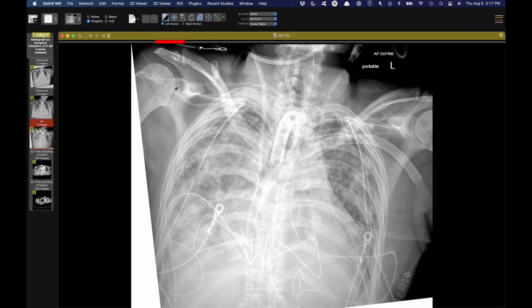And I'm actually curious why they got the radiograph, because when I read the procedure note, you'll see here's the right subclavian catheter. It takes an abnormally high course and crosses midline. We can see their bilateral internal jugular central venous catheter is going the expected location. And this clearly not going the expected location. And one would surmise it's probably in the descending thoracic aorta if it's not extravascular, given this high and medial approach. And this was actually an arterial placement.